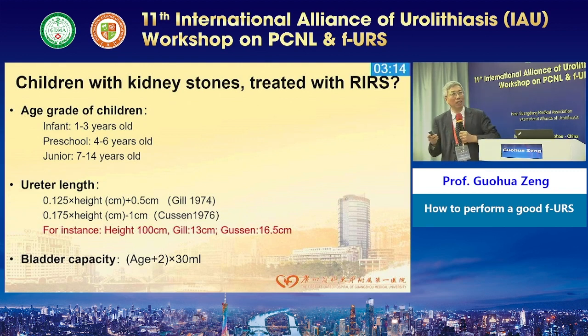How many people do pediatric flexible? You do? How many people? 1, 2, 3. I think for pediatric, flexible is not the first choice. For example, for this pediatric little stone, maybe it's 2 centimeters, maybe shock wave. Maybe super mini PCNL I will do.